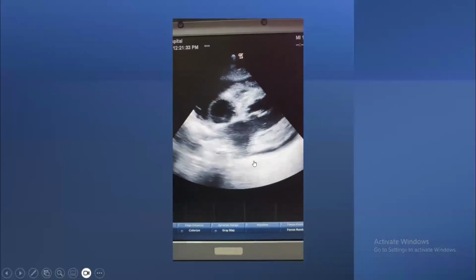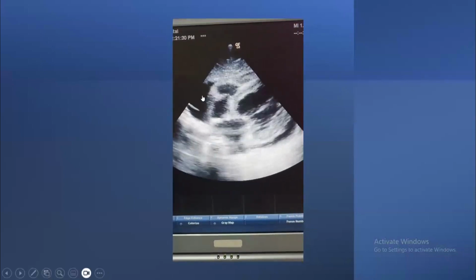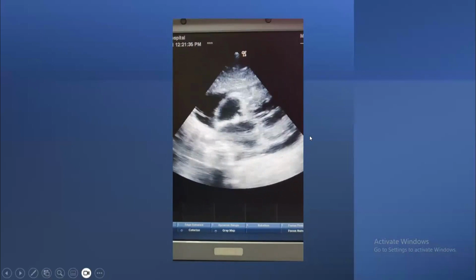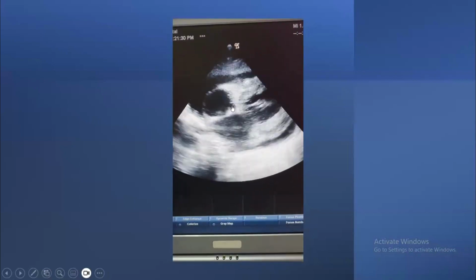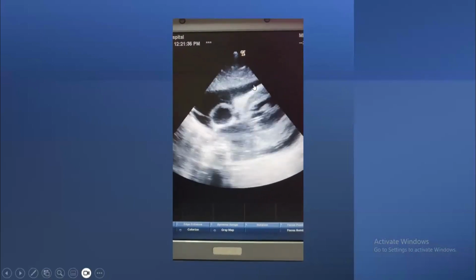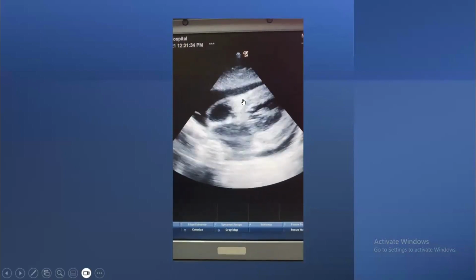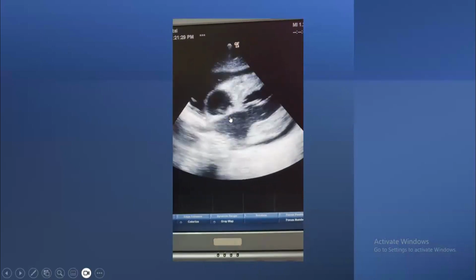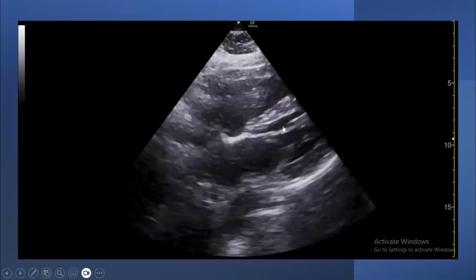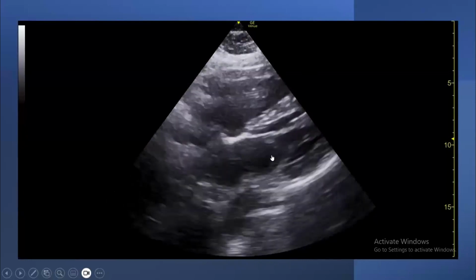Okay. This is one of my patients. Very important. Why? You can see that this is subcostal view. What you can see here is pericardial effusion, and down the liver, anterior and posterior pericardial effusion. And what you can see in the pericardial effusion is that the right ventricle is collapsible. This is a sign of tamponade. There is collapse of the right ventricle during diastole. This is pericardial effusion with tamponade from the subcostal view. Another subcostal view. We'll pass it now.